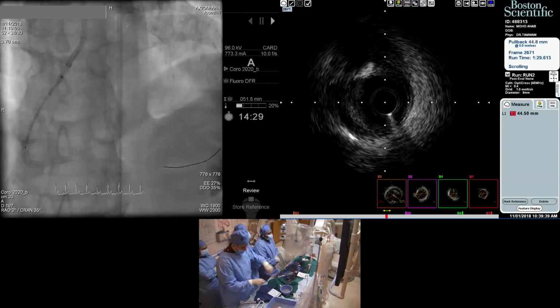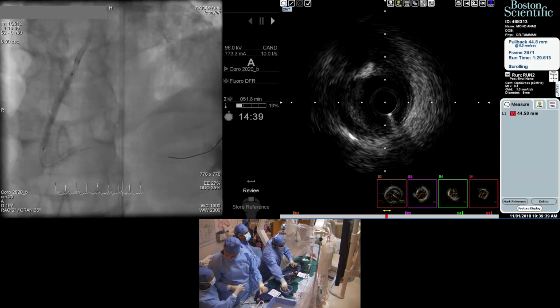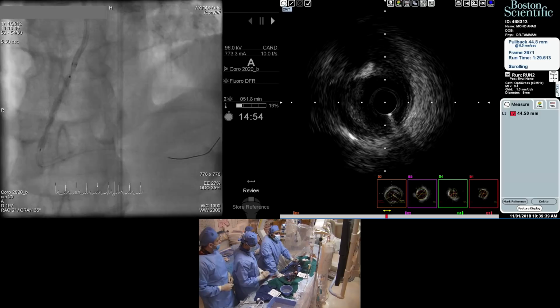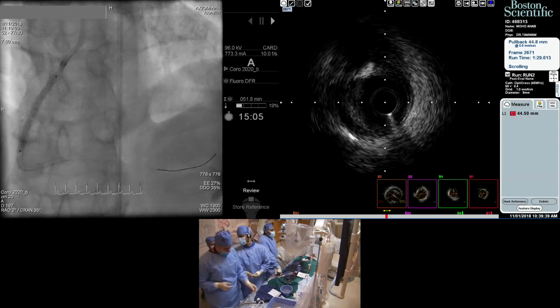That's what I want to say. Sometimes I just treat the distal artery with a drug-eluting balloon, and we have a good result with this. Just a stent in the CTO segment, and then a drug-eluting balloon in the distal artery. I believe the damping of the pressure, as Dr. White said, was because the guiding was deeply engaged at the ostium of the RCA, so that's why we got some damping of the pressure. But the patient is now very good.